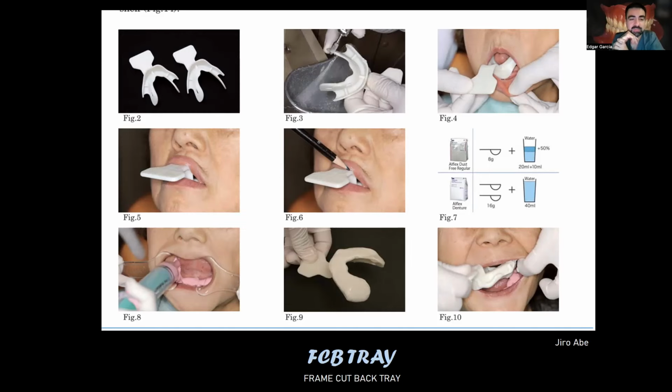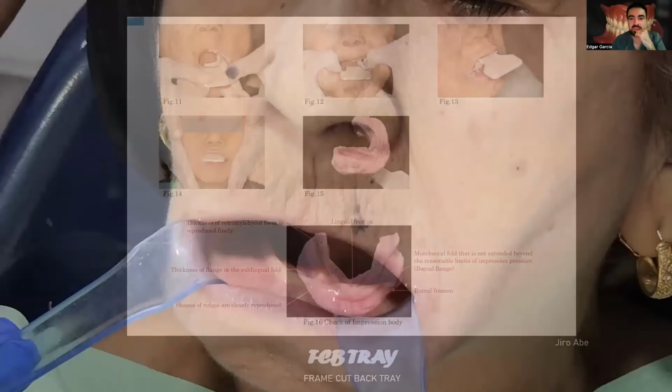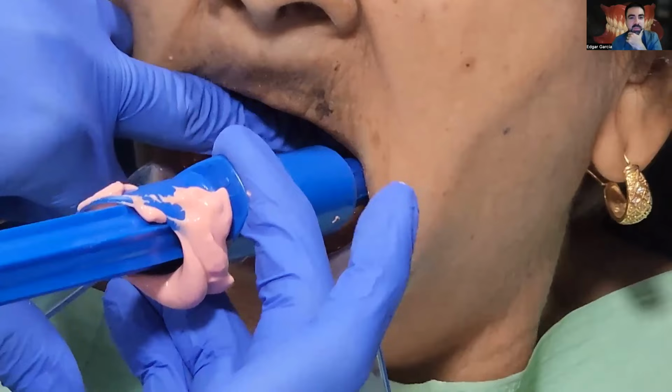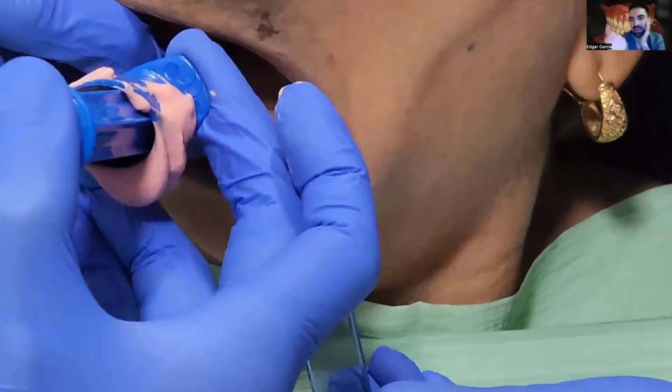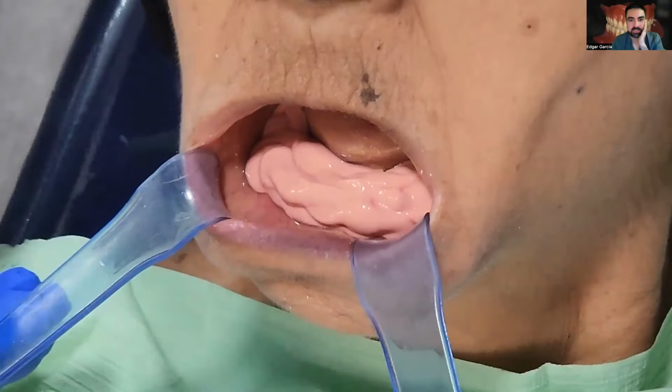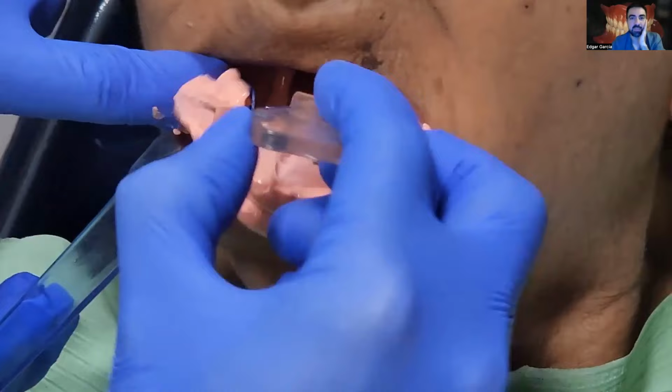As you are going to see in the video, almost 90% of the alginate is going to be injected. I start at the retromolar part, go all through the lingual part of the mandible, and just inject everything. And you're using regular alginate? Exactly. As you can see, I have a lot of time to work. Then I go with the tray, insert it in the mouth, ask the patient to elevate the tongue a little bit, and close the mouth.